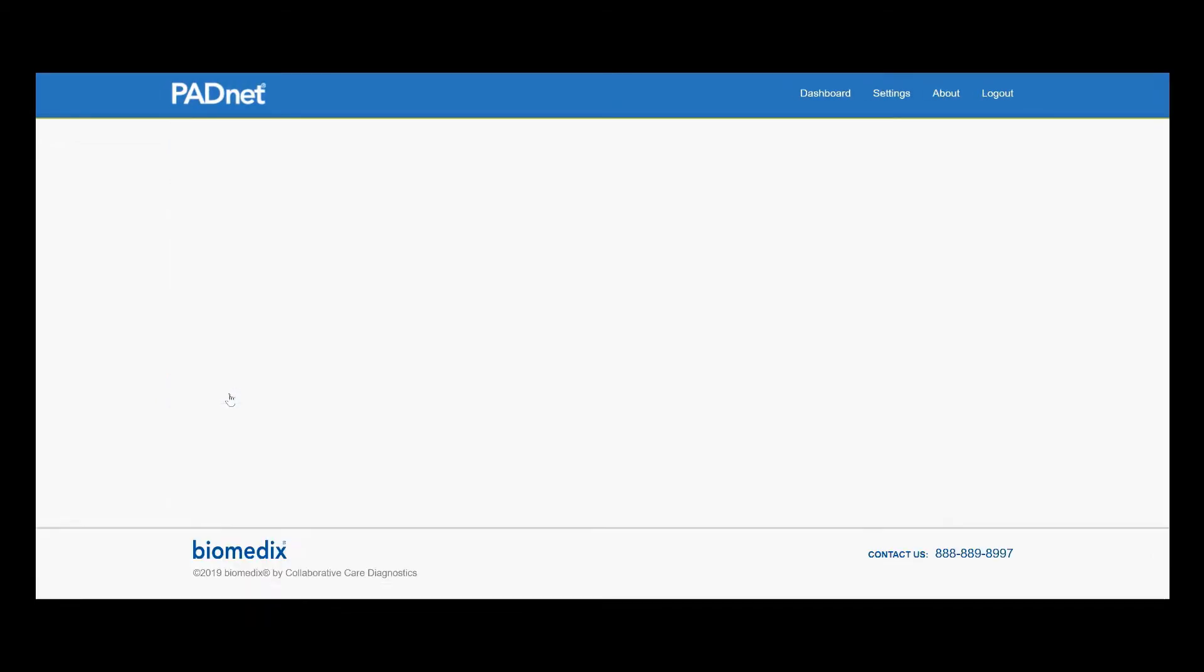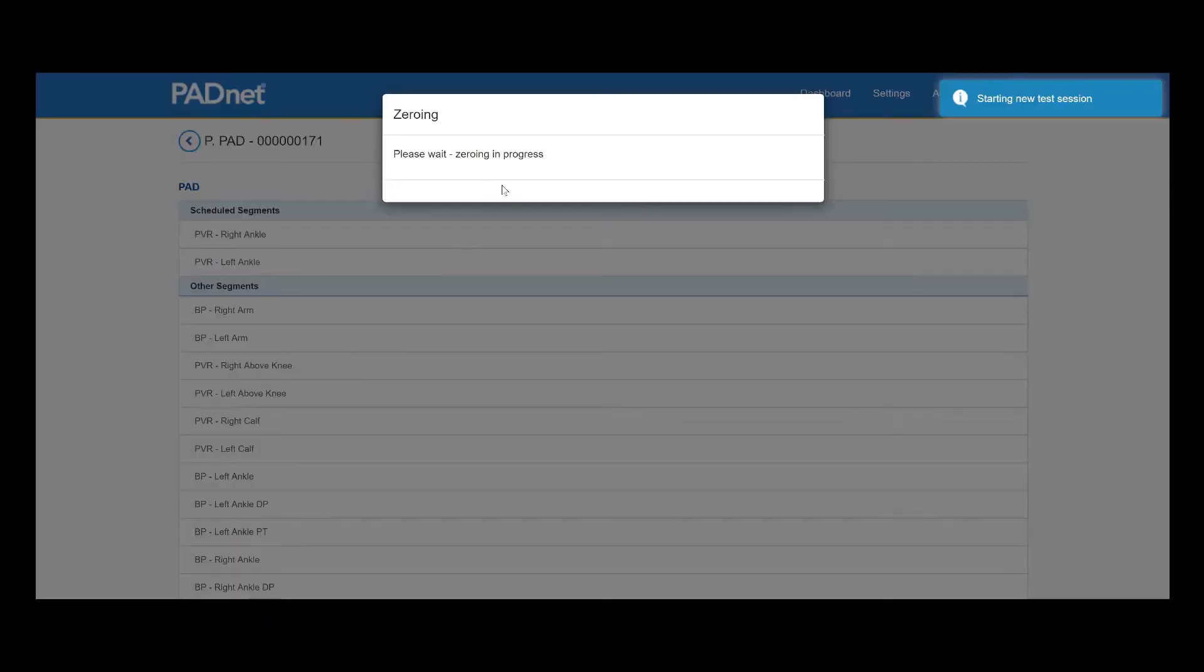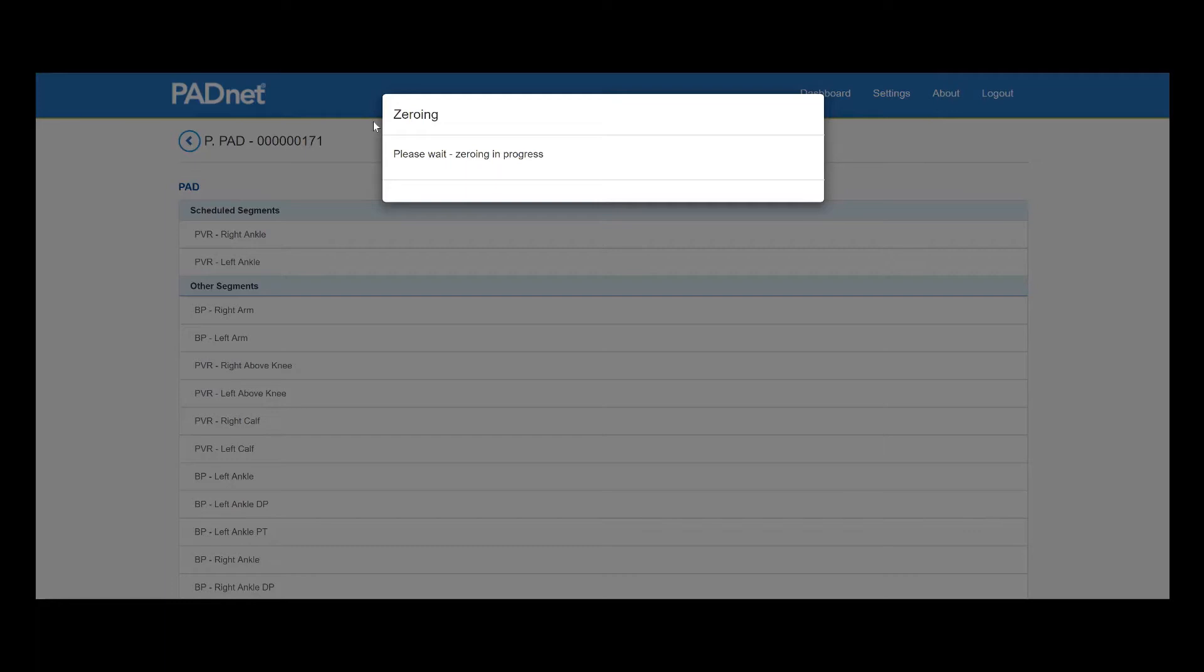Now that our patient is ready to go, we can click on the name and it will begin calibrating the pressure sensor. I recommend that this is when you have your patient conduct their 30 heel raises.